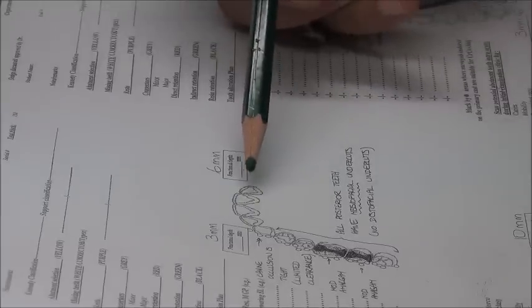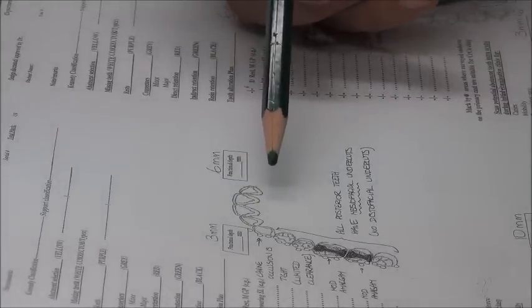A retentive arm. Can I place retentive arms on a lateral? No. And I have a large edentulous area. What is my main retention I'm going to get here? I could not get direct retention. What other options do I have? Indirect retention. Indirect retention is something else. It is rests, the balance for rotation. It's something else. What is the other type of retention?